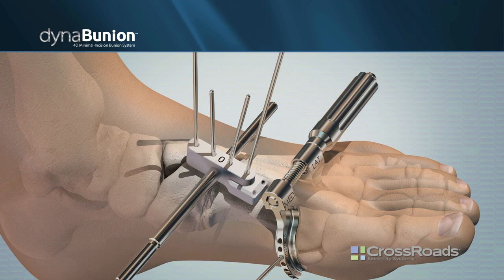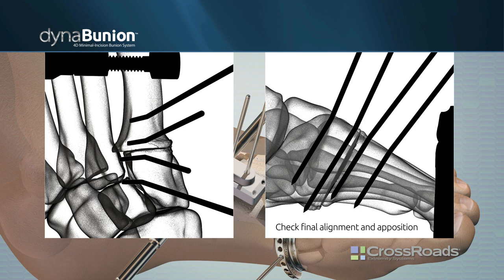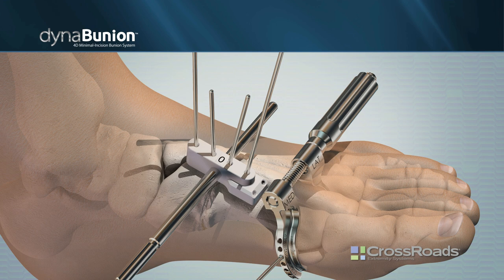Apply plantar counterpressure to ensure the force from the block does not plantar shift the metatarsal. Visually confirm satisfactory bony apposition of the first TMT joint and confirm under lateral fluoroscopy if desired. If additional bony apposition is needed, remove RAC block 0 and place one of the additionally provided blocks. Increasing number corresponds with increased compression.